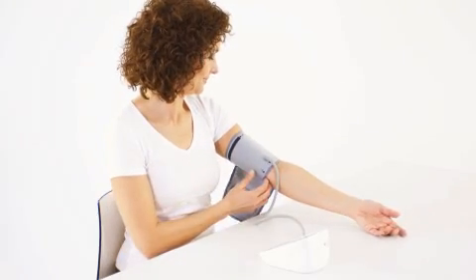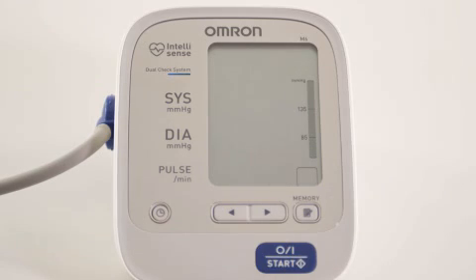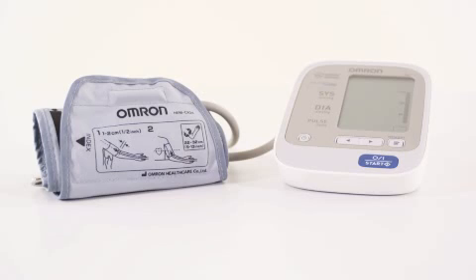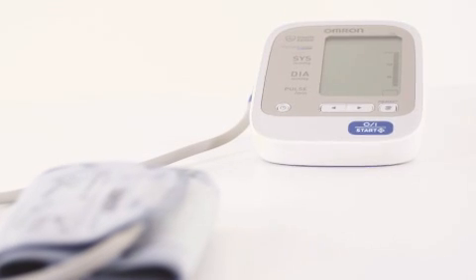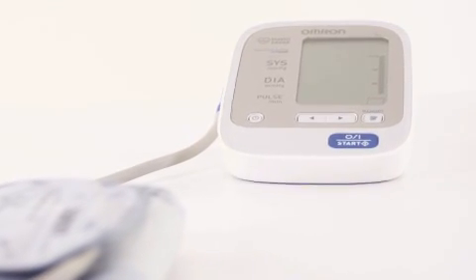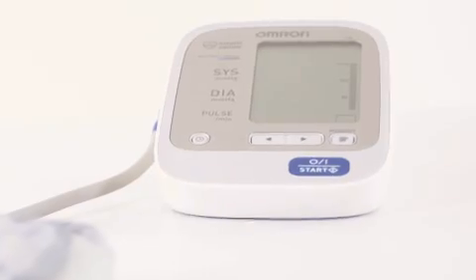Take the cuff off and press the on-off button to turn the monitor off. The measurement is automatically saved. The M6 blood pressure monitor has a memory for storing up to 90 measurements. In addition to this, it can also calculate the average value of the last three readings measured within 10 minutes for precise and accurate readings.